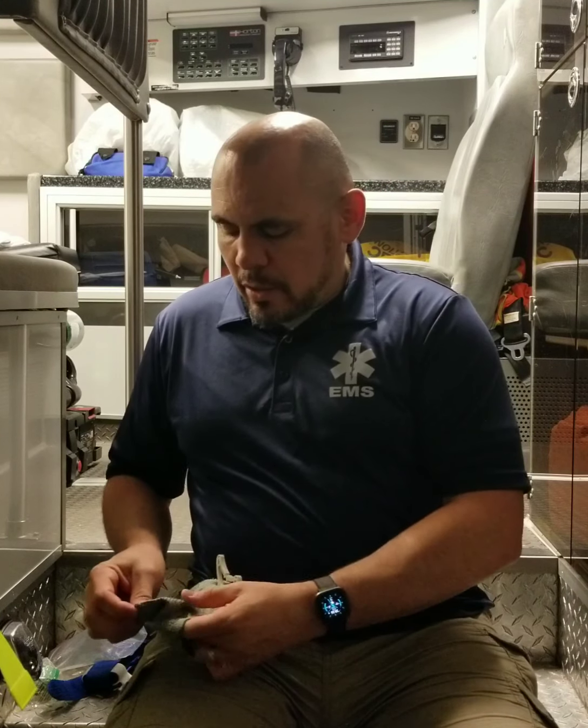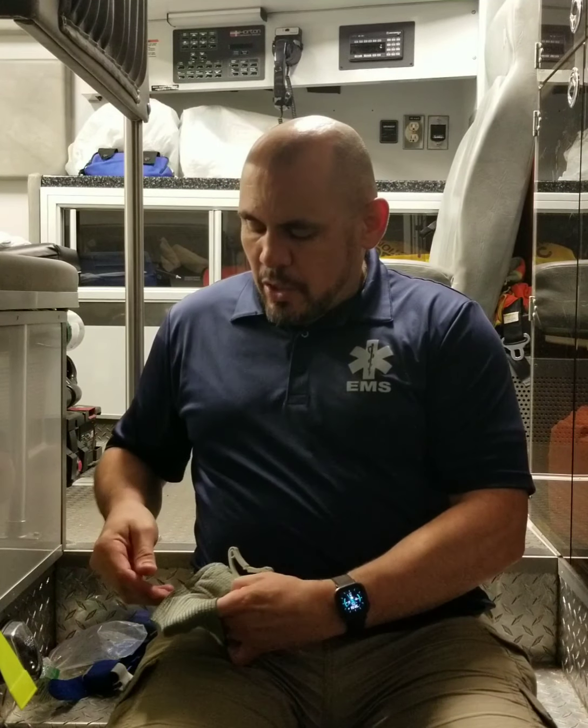Now, another option could be this is a pressure bandage. So technically this is a commercial version of this. This particular one is what is called an Israeli bandage. Now the beauty about this particular one is that it's good for putting it on yourself if your laceration or cut is on your arm. For example, it's got a little bit of a loop here that you would slide your hand through. So let's just say the cut is in this hand. You would slide it through.